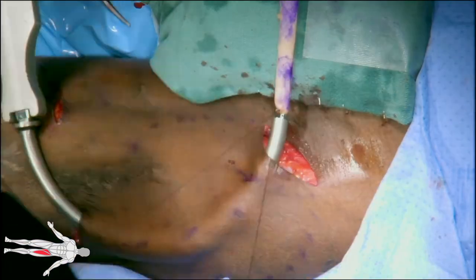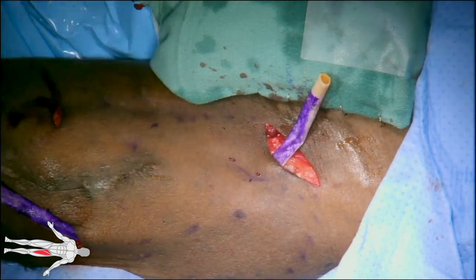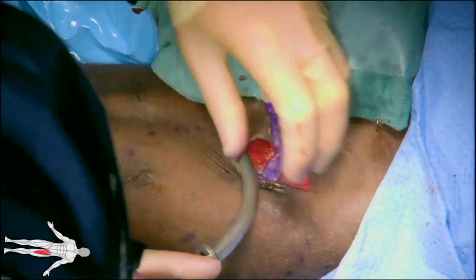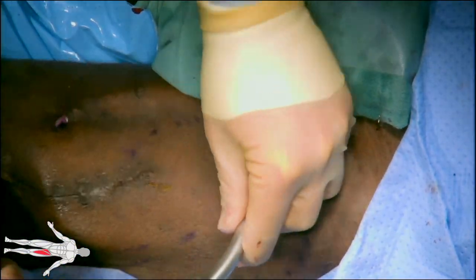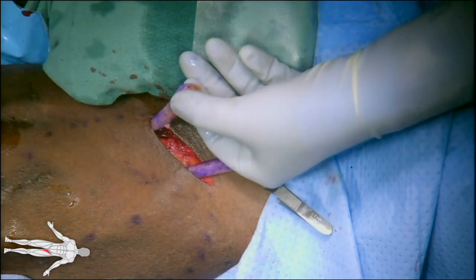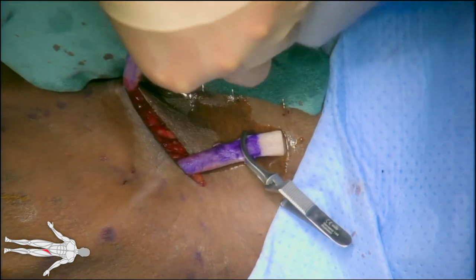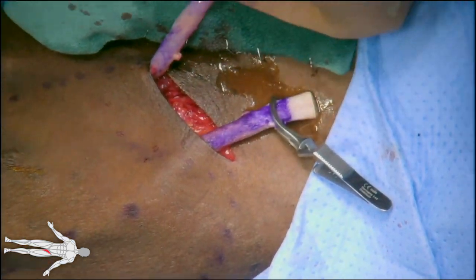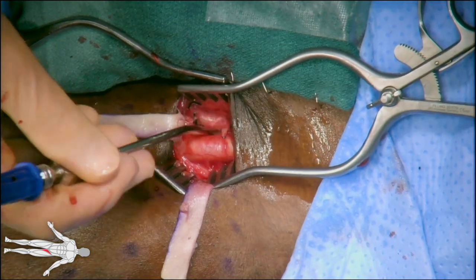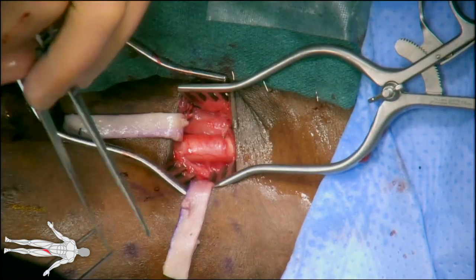The graft is then tied to the tunnel and pulled through the tunneler. Once the graft is tunneled, a bulldog clamp is applied and the graft is flushed to make sure there is no twisting or kinking of the arterial graft. The orientation of the graft is such that the venous limb lies in line with its outflow.